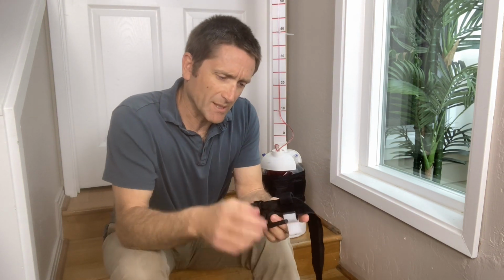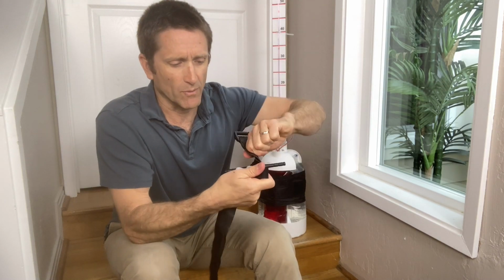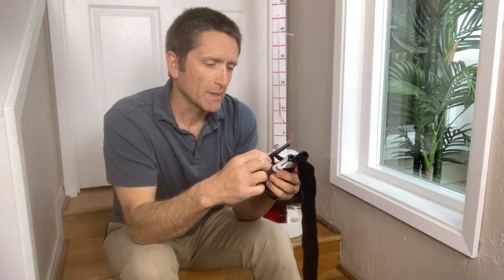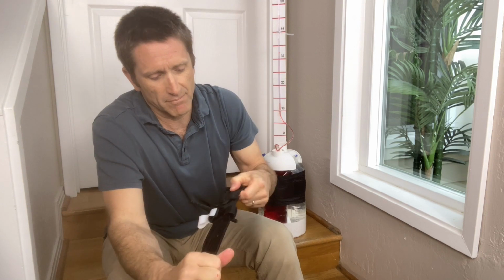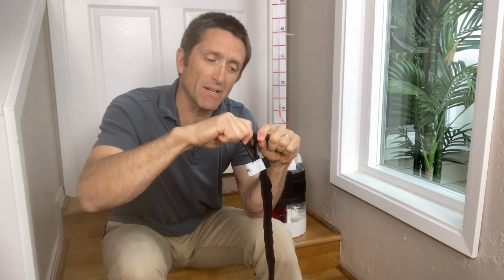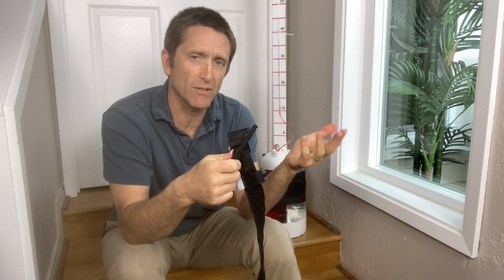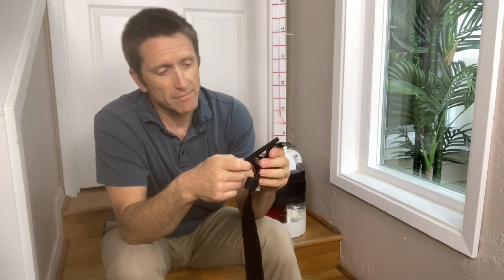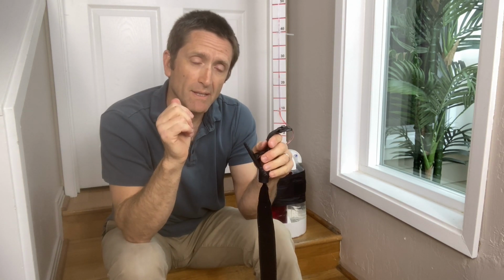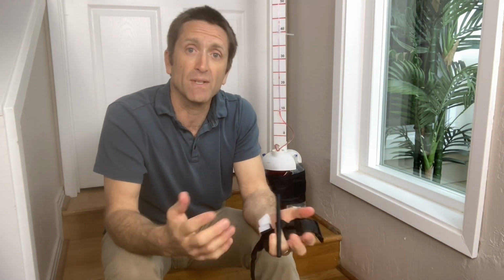All right, so this actually didn't break. This had some twisting and some, you can see where it was getting all bunched up, but at the end of the day, this held up. So it's kind of interesting to me. This is the type of cat that people don't love, and I can definitely break this, but it actually would still provide pressures that are similar to the cat. So the bottom line is, I think that this helps us to know what torque is reasonable and also what the peak pressures are that are reasonable using a circumference that is 58 centimeters.